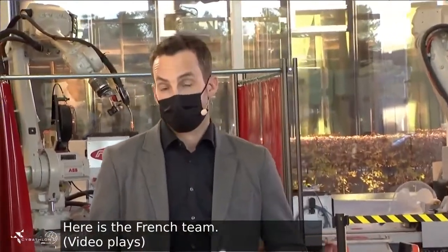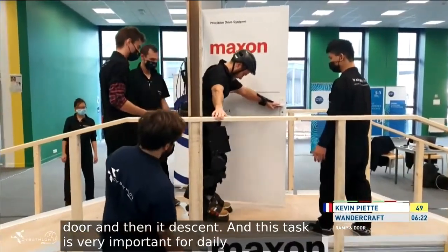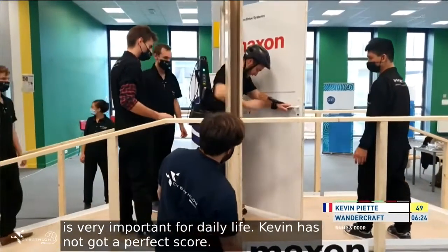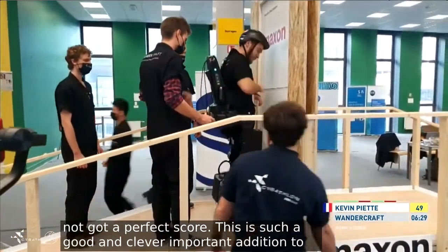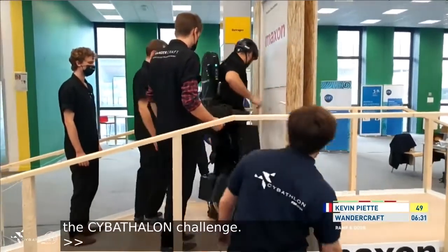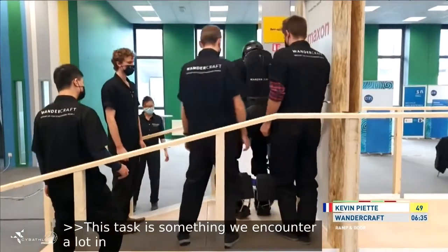The French team — the team that races without crutches. The first time we see the Rampandoor, and it's such a good, clever, and important addition to the Cybathlon Challenge. Yes, for sure. This is something that we encounter very much in daily life, and it really needs the work of the arms to be able to do this kind of task.